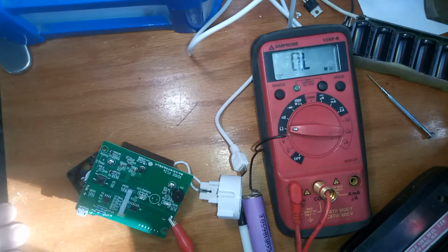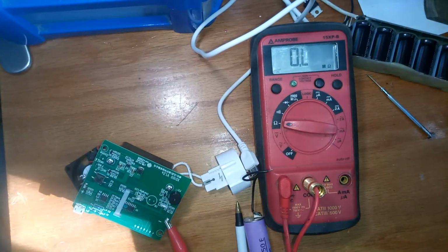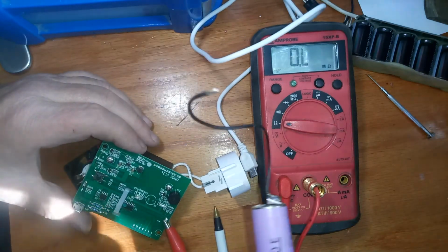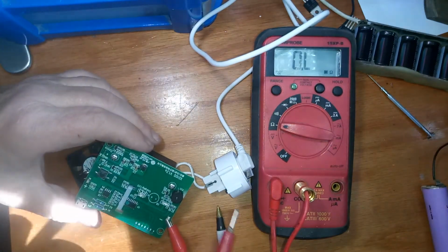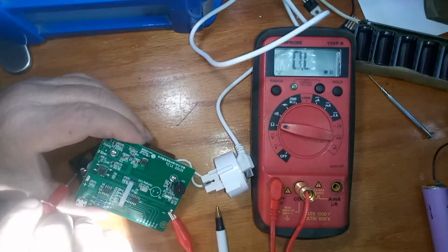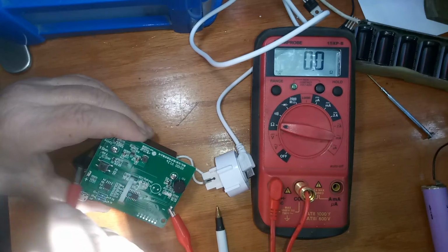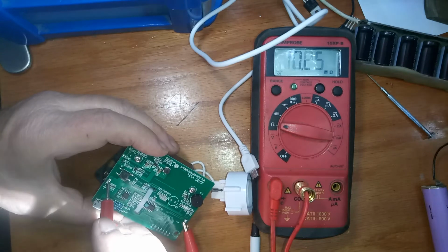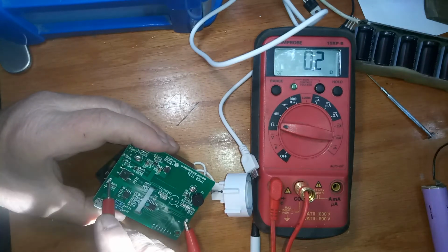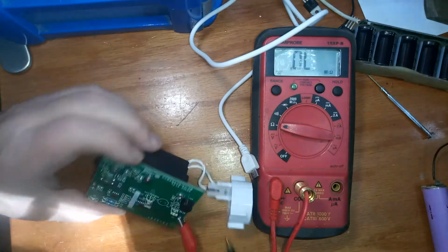Well, I've unsoldered the positive side of the battery, and it looks like really bad news for me. I got really screwed on this one. I was going to substitute in this lithium battery that I got out of some old laptop. Not the best, but anyways, I checked the lithium battery, and it says 0 ohms. But worse than that, I unsoldered it, and if you go over to the positive connection, it's still shorted out.